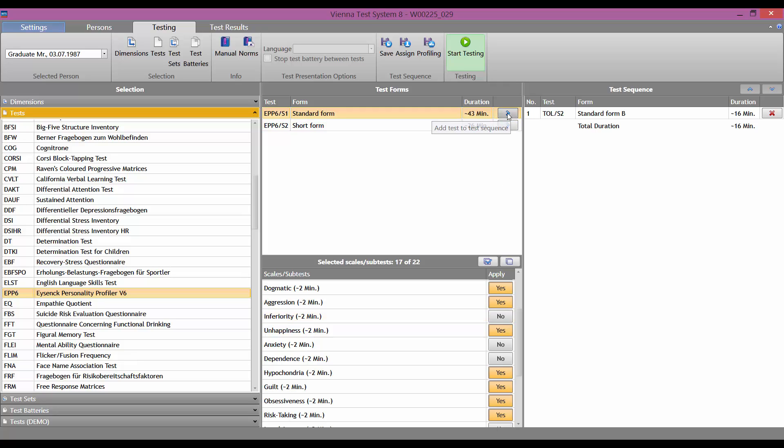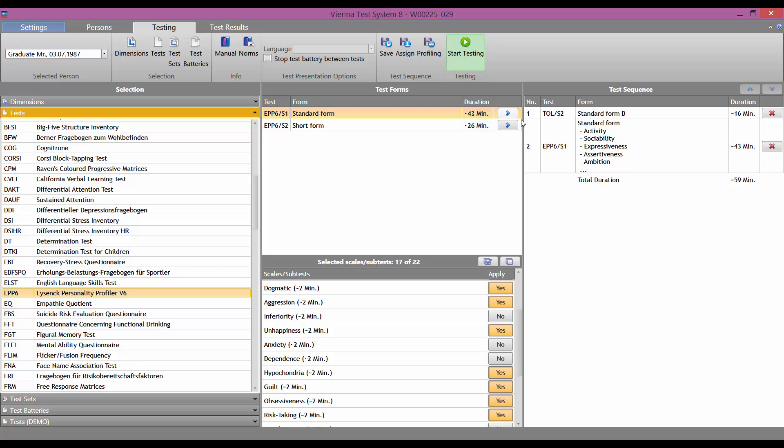click on the blue arrow on the right, at the top, under the test forms, to move the test into the test sequence column, so that testing is ready to start.